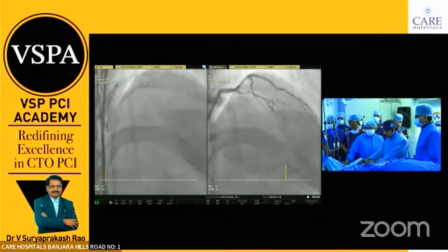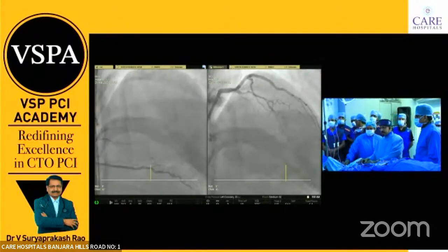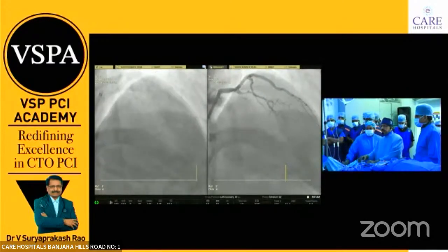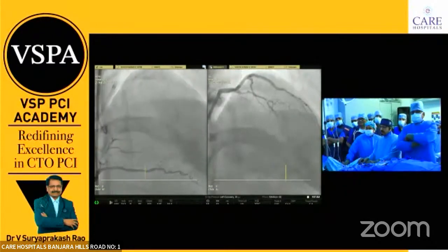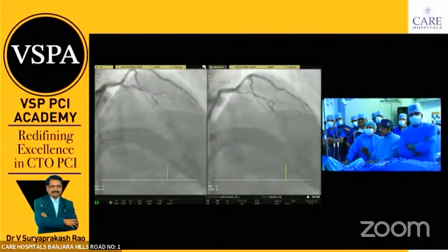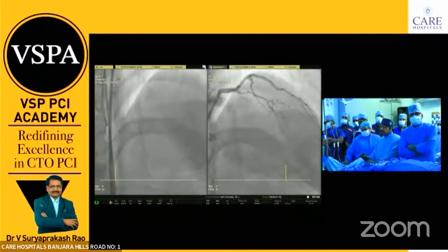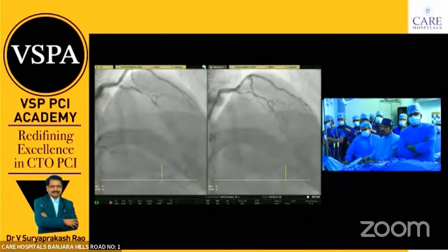That's why I always take microcatheter support in these cases, but the initial wire should be a very flexible wire which you can track to the proximal cap. If you use a dedicated CTO wire to the proximal cap, you may lose the tip. The secret of success of CTO wires is the tip, so you should not lose the tip character. That's why I use another wire first.